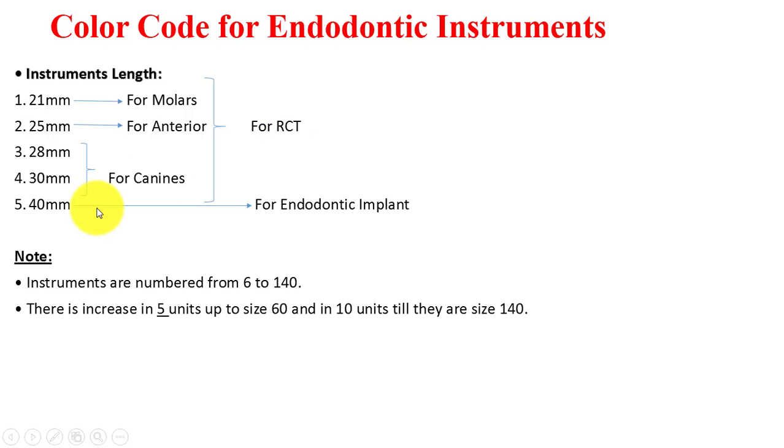But we have one more, that is 40 millimeter, which is used for endodontic implants, a specialty topic that we're not going to talk about. So 40 millimeter instruments are used for endodontic implants.